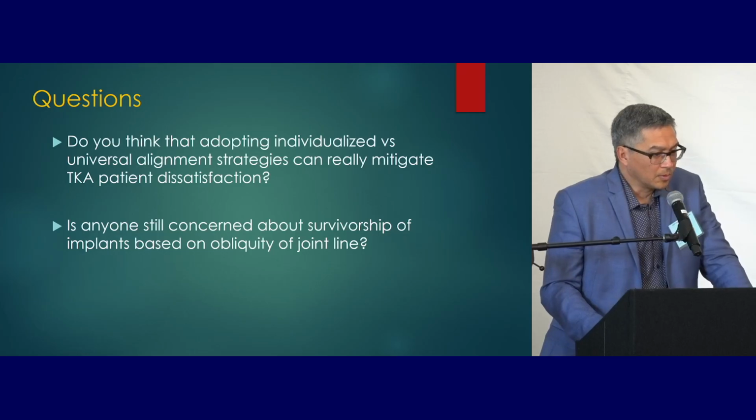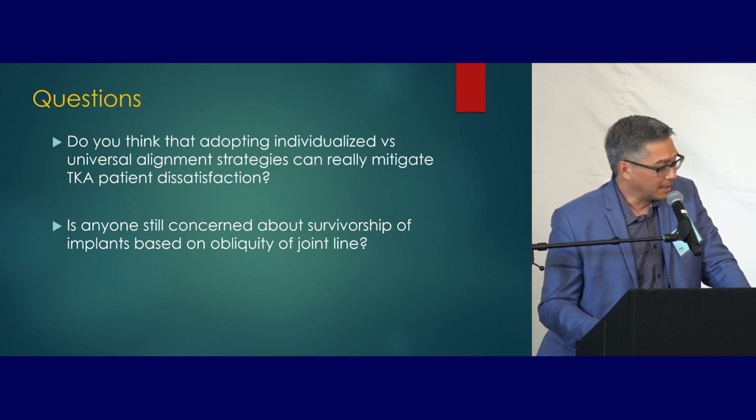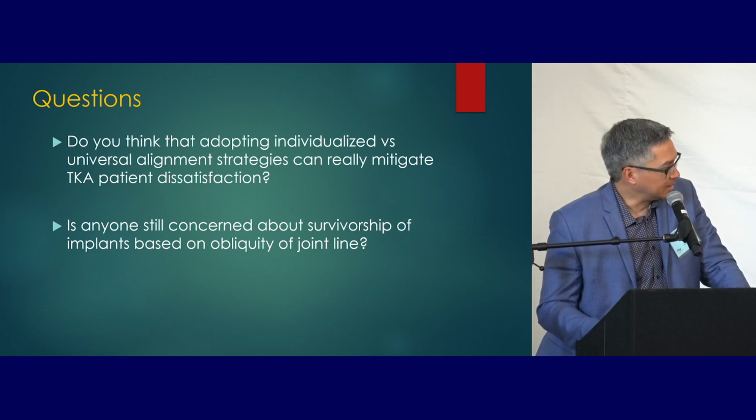I agree. I just don't think we know enough about the dissatisfied patients and whether alignment plays a role in that or not. It's hard to know. So there was a lot of concern initially that putting these knees in with an oblique joint line would lead to failures and ultimately revisions. Is anyone on the panel still concerned about the survivorship of implants based on this joint line obliquity? I would say yes.